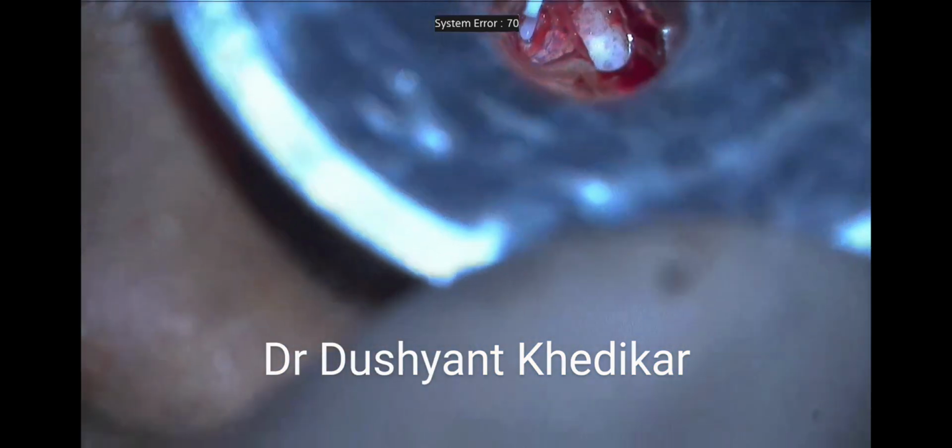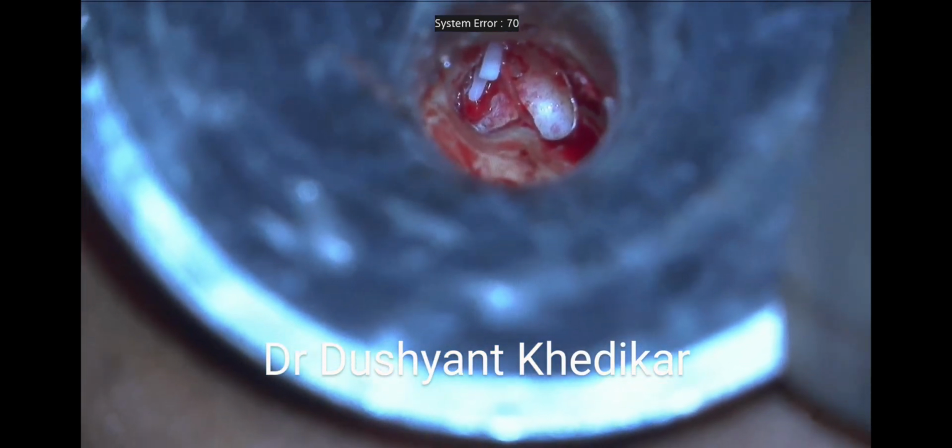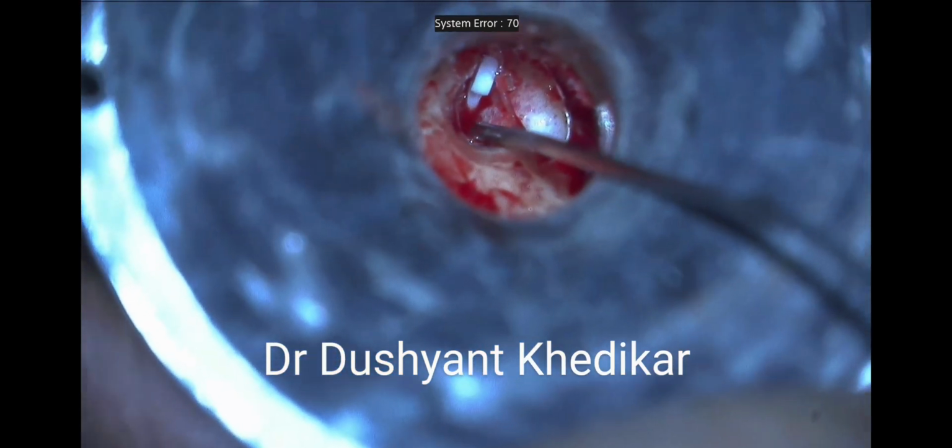Once the positioning of the shaft is confirmed, next the loop of the piston is crimped gently onto the long process of the incus, ensuring a snug fit between the piston and the incus long process. A snug fit is essential to prevent the play between the piston loop and the long process of incus, thereby minimizing the chances of erosion and necrosis of long process of incus.